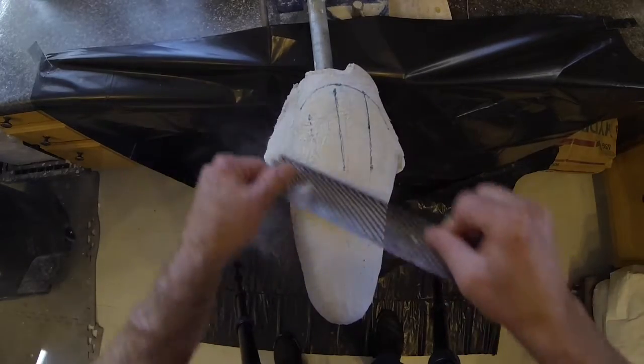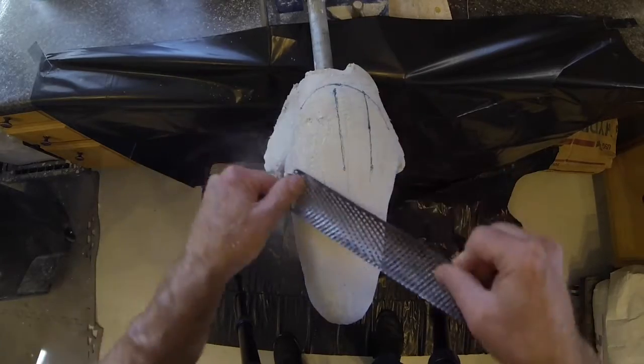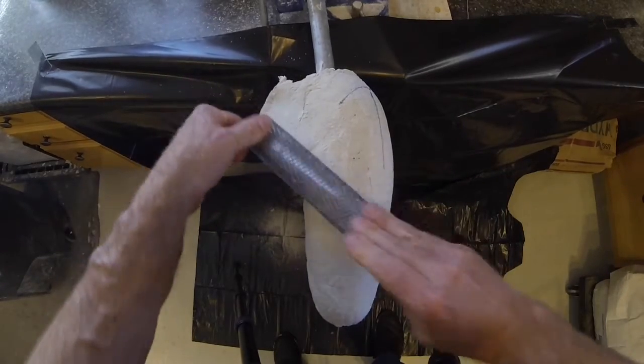Begin the modification by smoothing the cast using a half-round shore-form file. Eventually, all high spots will be removed so that the entire cast has been touched by the file.